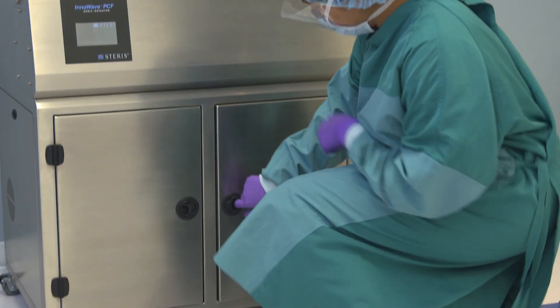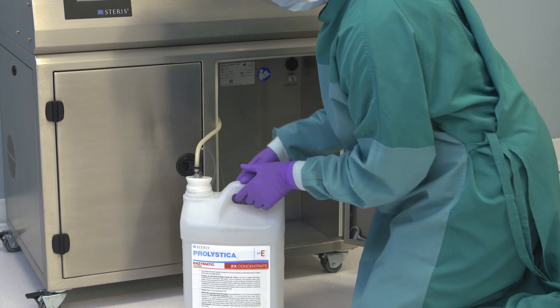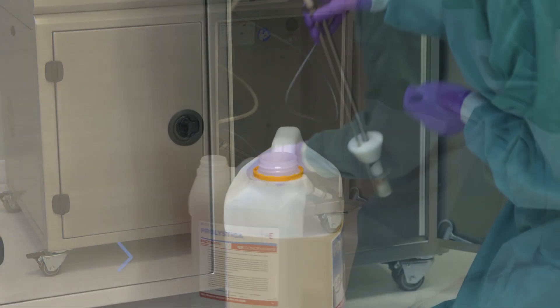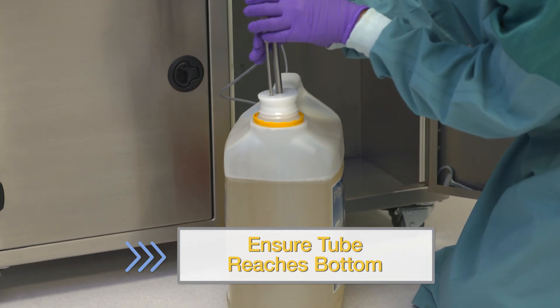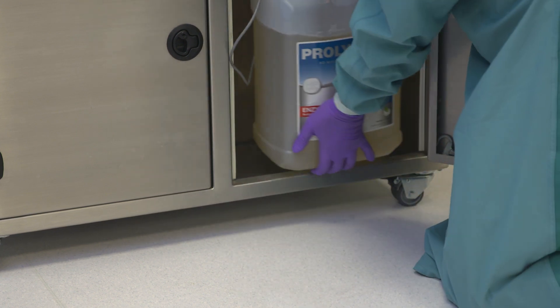You will need to hook up chemistry before using your ultrasonic — at initial install and every time chemistry is being changed, the lines need to be primed to ensure proper dosing and prevent cycle errors. Prime the lines by placing the chemistry pickup tube in the new chemistry bottle, making sure it reaches the container's bottom. Secure the new chemistry in the bottom of the cabinet.